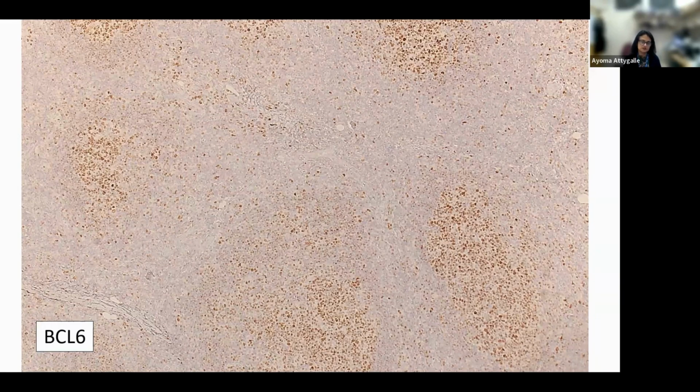Just to say, in follicular lymphoma, CD10 and BCL6 are upregulated when there is an FDC, follicular dendritic cell, milieu, and are downregulated outside of the follicles where there are no FDC meshworks. Similarly, if you look at bone marrow involvement by follicular lymphoma, these would also have downregulated BCL6 and CD10, except by flow, which picks it up. It's not always easy to pick it up on immunohistochemistry on a bone marrow trephine.